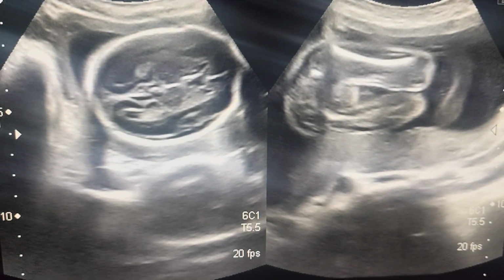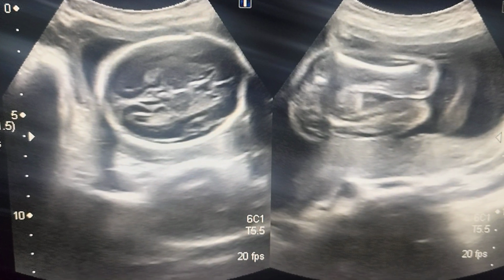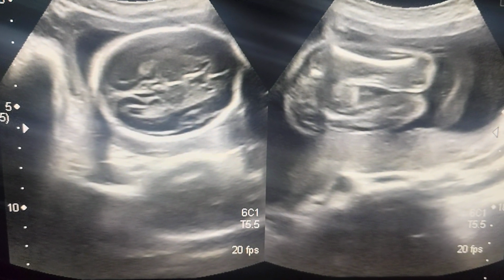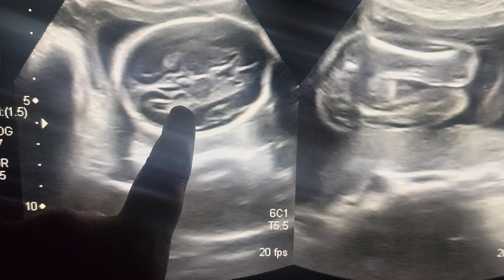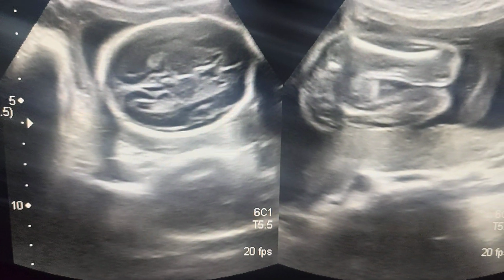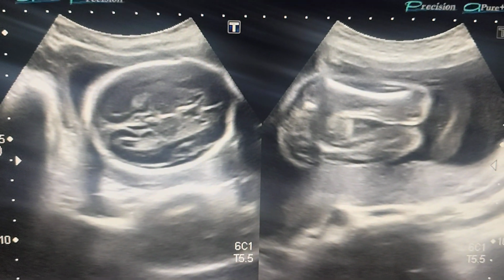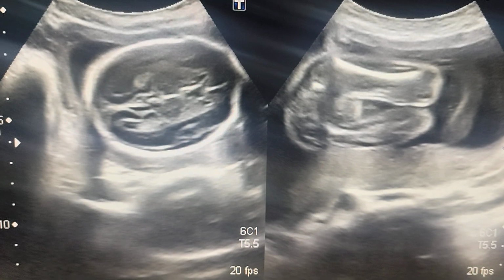Today in this pregnancy ultrasound video we will discuss fetal biometry parameters. So in this video you can see this is a fetal skull biparietal diameter, this is a femur length, which are two important parameters used in fetal biometry to estimate the gestational age and fetal weight.